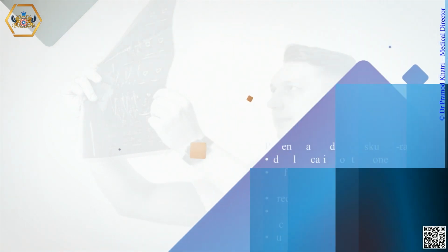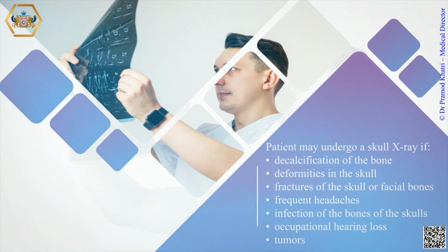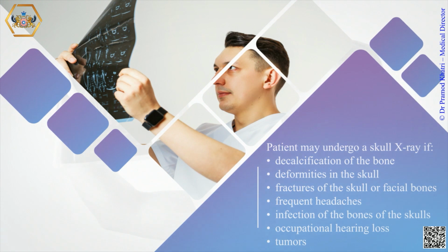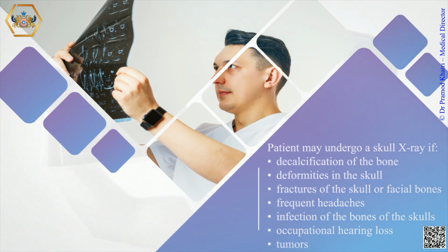A patient may undergo a skull X-ray for decalcification of the bone, deformities in the skull, fractures of the skull or facial bones, frequent headaches, infection of the bones of the skull, occupational hearing loss, or tumors.